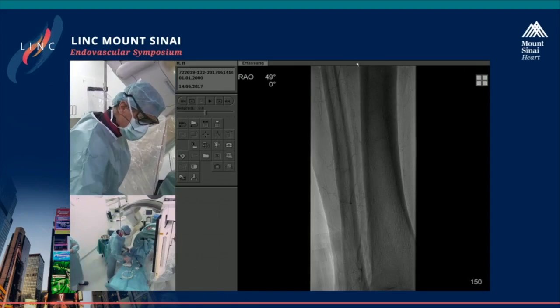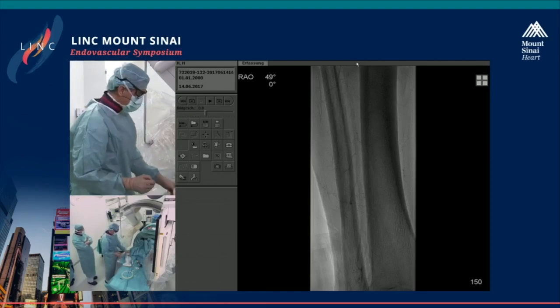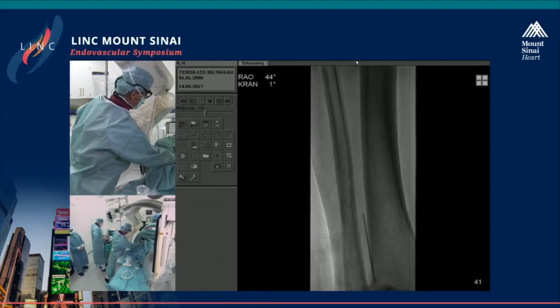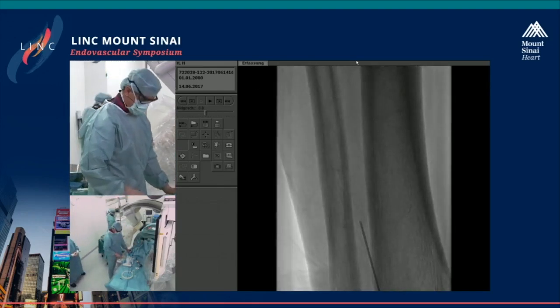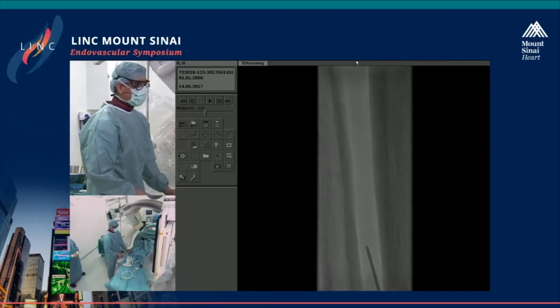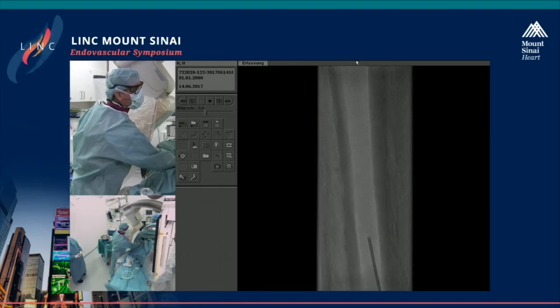Yeah, I gave already some local anesthesia. It's a 7 centimeter long 21 gauge needle. A pedal puncture set actually comes with a 4 centimeter long one, which I think is too short here for this access, because the artery is relatively deep here in the calf. And of course now I will magnify a little bit, and Svenny will tell me when blood will come out of the needle here.